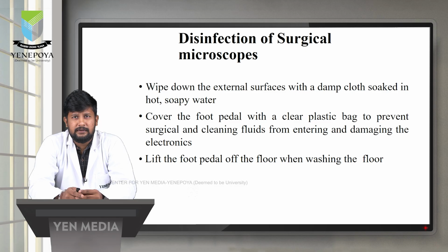Wipe down the external surfaces with a damp cloth soaked in hot soapy water. Cover the foot pedal with a clear plastic bag to prevent surgical and cleaning fluids from entering and damaging the electronics. Lift the foot pedal off the floor when washing the floor.